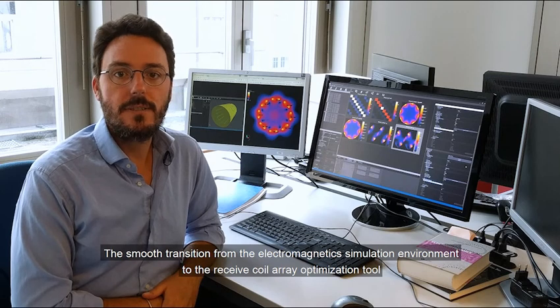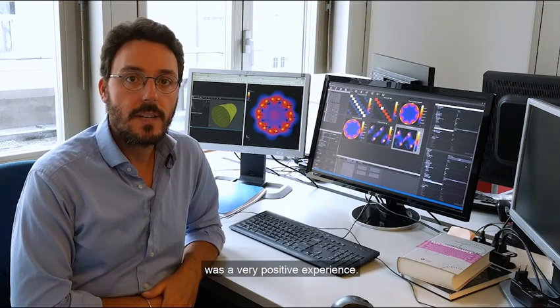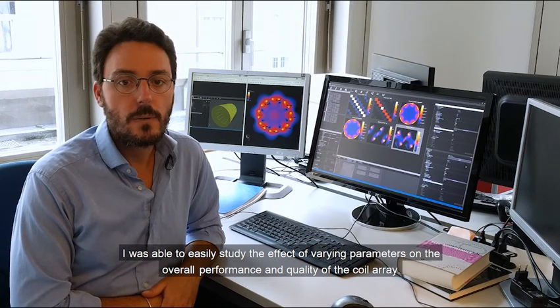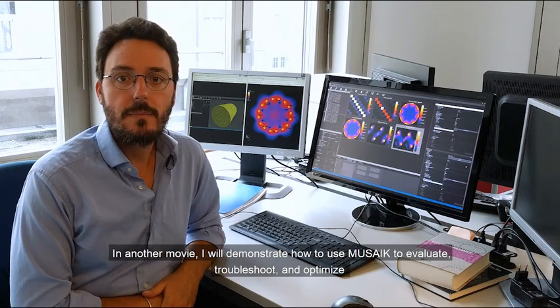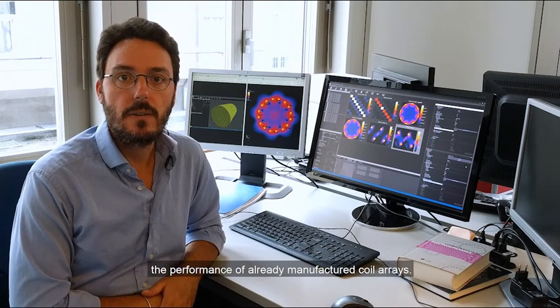The smooth transition from the electromagnetic simulation environment to the receive coil array optimization tool was a very positive experience. I was able to easily study the effect of varying parameters on the overall performance and quality of the coil array. In another movie, I will demonstrate how to use Musaik to evaluate, troubleshoot, and optimize the performance of already manufactured coil arrays.